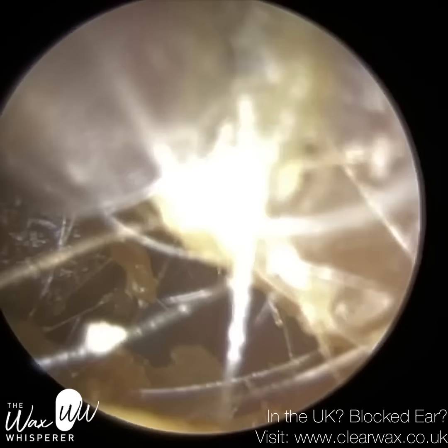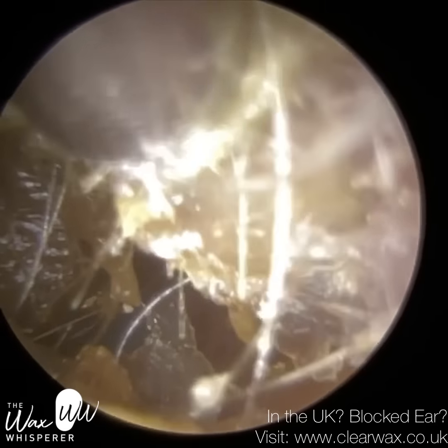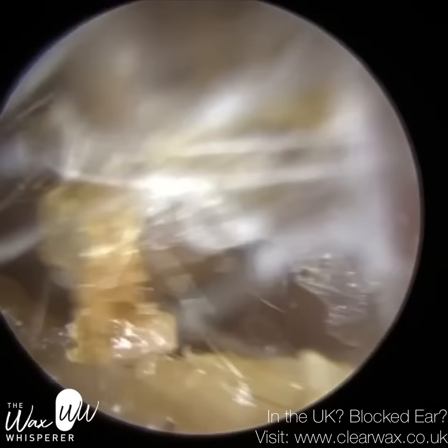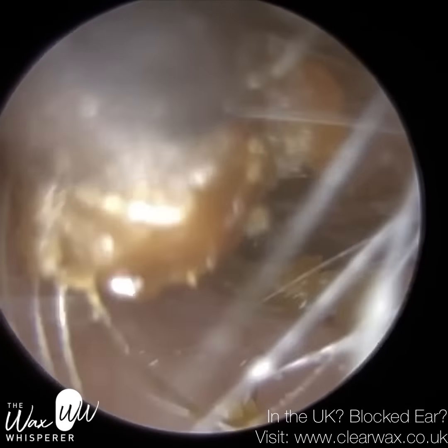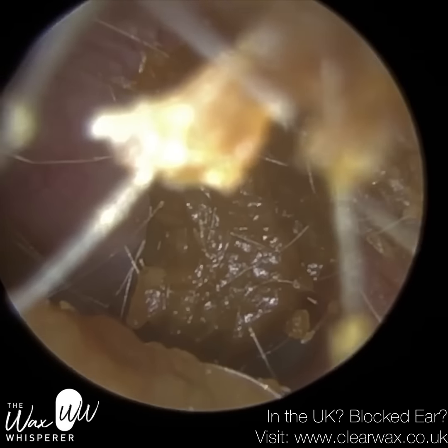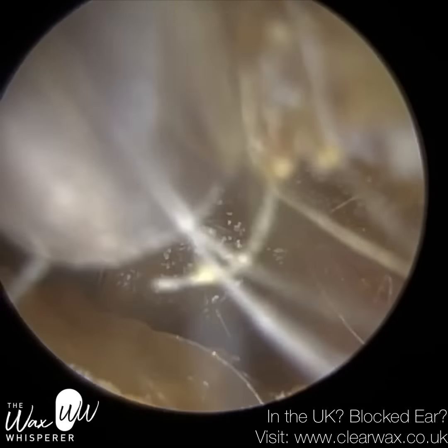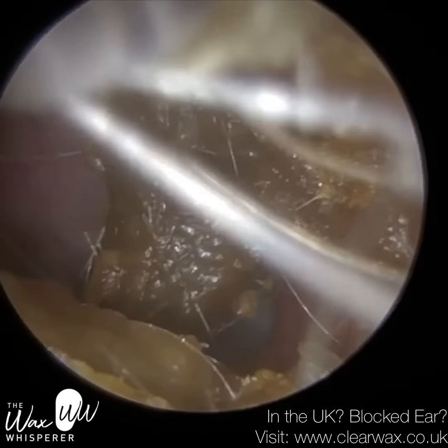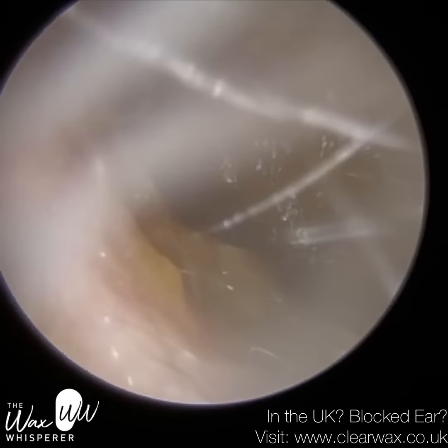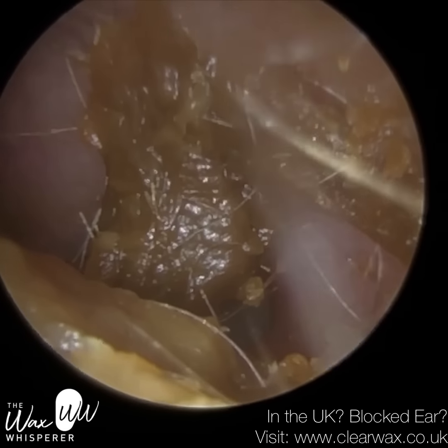We call the microsuction tube I use a Zollner suction tube. It's a standard tube that we use. The diameter, give or take, is around 2 mil, 2.1 mil, and that's the outer diameter. The internal diameter is around 1.7 to 1.8 mil. So it's a very thin wall thickness. They're made out of medical grade surgical stainless steel.